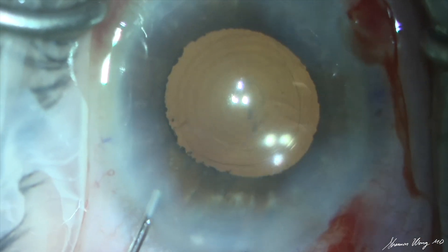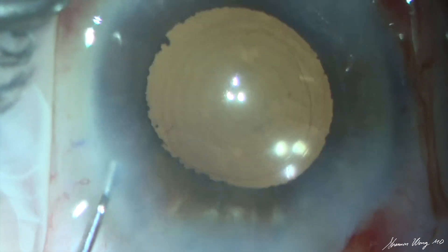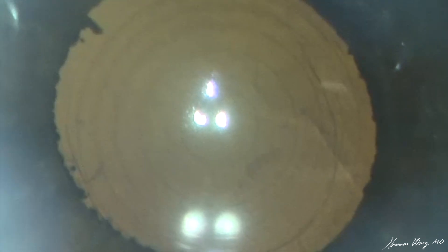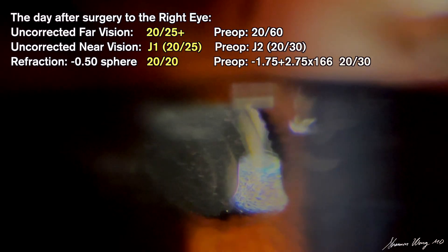At the conclusion of the case, the PanOptix central optic appears centered under the Lumera microscope lights. The next day, the implant appears in the eye with the patient's pupil in its natural state. The central optic of the PanOptix is inside the pupil but slightly decentered toward the eight o'clock position. There is trace pseudophacodenesis. The vision on post-op day one is then assessed.